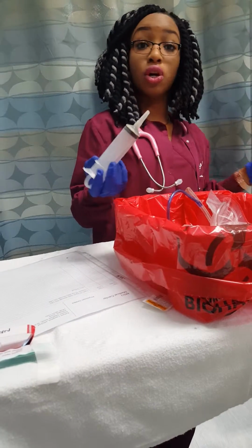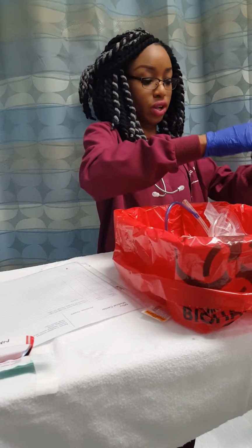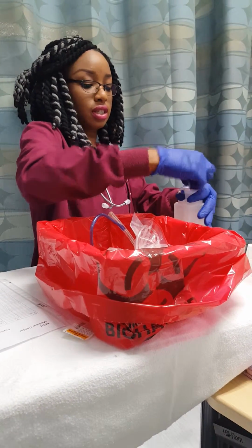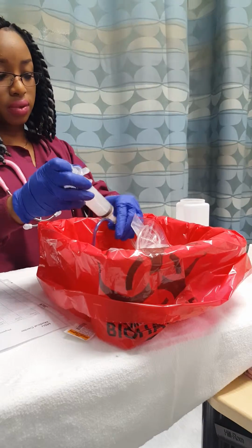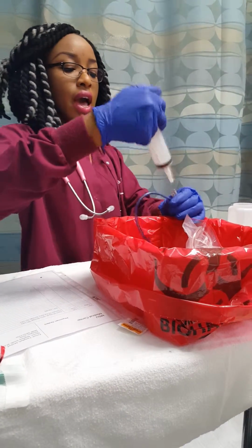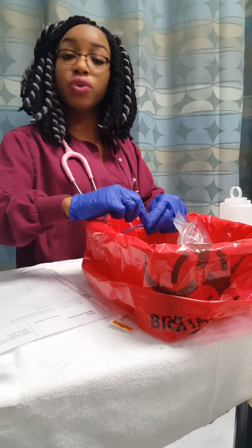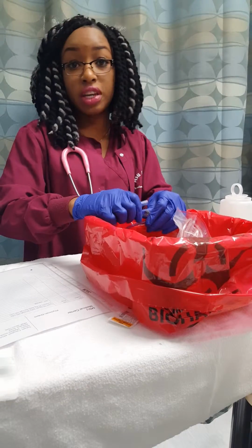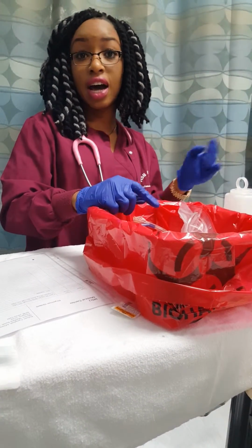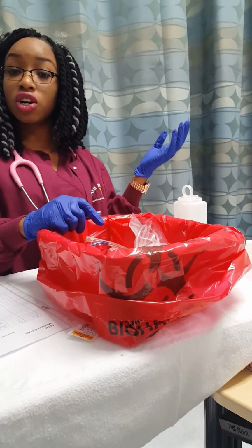Before I close it up, I have to also flush again for the last time with another 30 cc's of normal saline. So drop another 30 cc's, insert it. Alright, and you have to make sure before you close it, you close it in for at least 30 minutes just for that medication to work and make sure that it is completely inside.